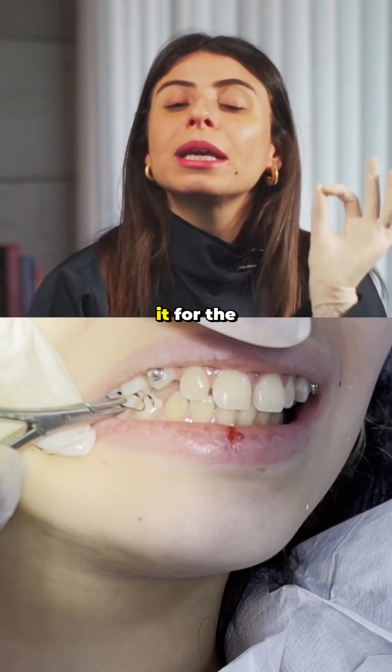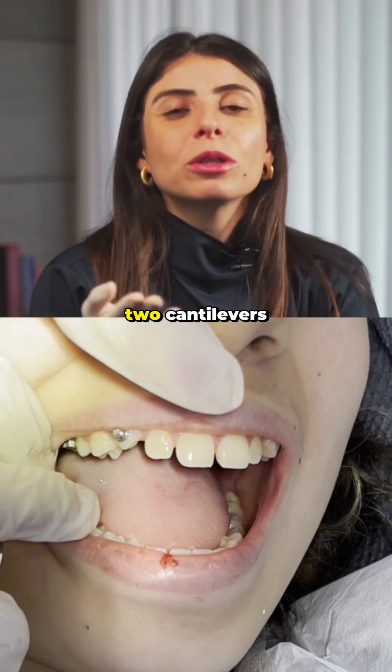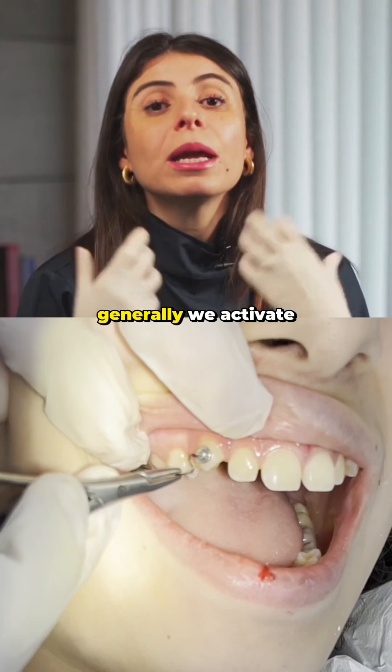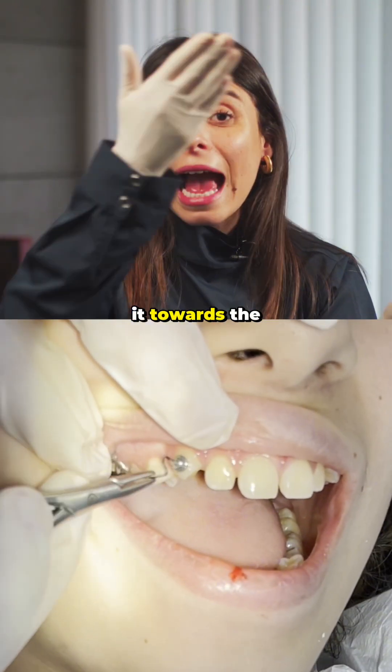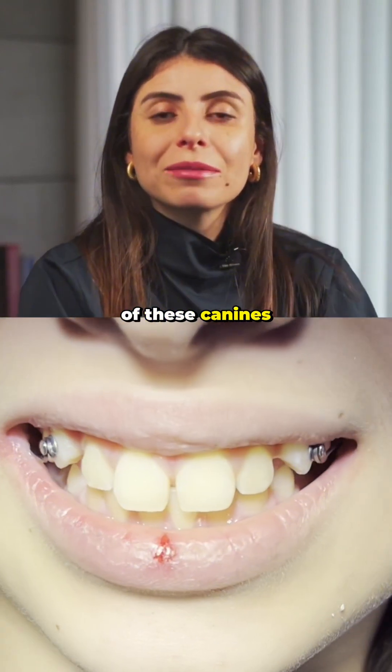We frequently use it for the traction of impacted canines, as in this case shown, where we have two cantilevers to adjust the position of the canines. Generally, we activate it towards the incisal to achieve the extrusion effect of these canines.